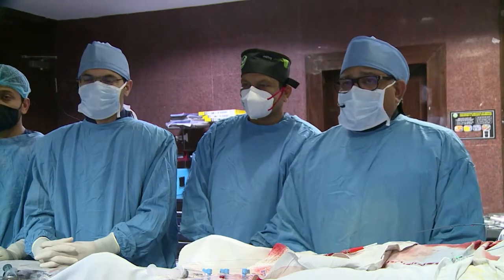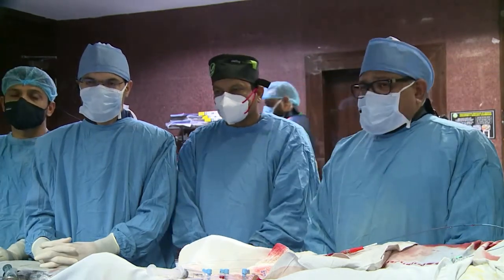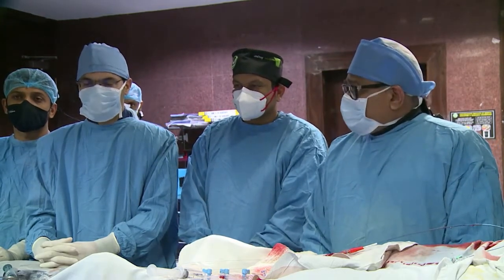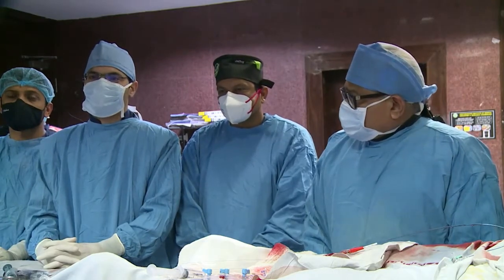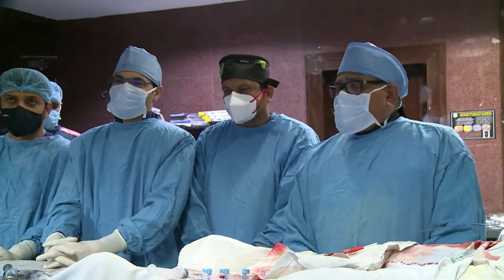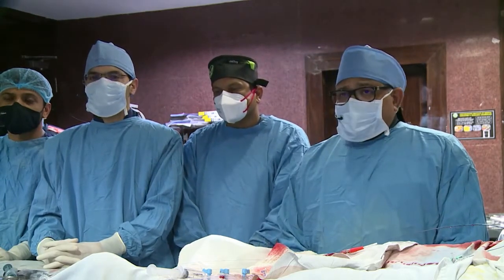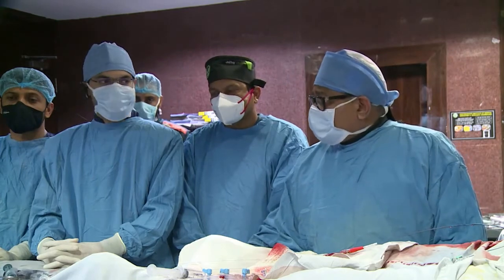I am Dr. Rajesh, Professor, Department of Cardiology. With me, Dr. Basant is there, Associate Professor in the department. Dr. Ganesh is a Senior Research Fellow, and Dr. Atit is the Research Fellow from the department. I also have Puneet with me, who is looking after IVUS and the FFR. So let's go ahead with the PowerPoint presentation.